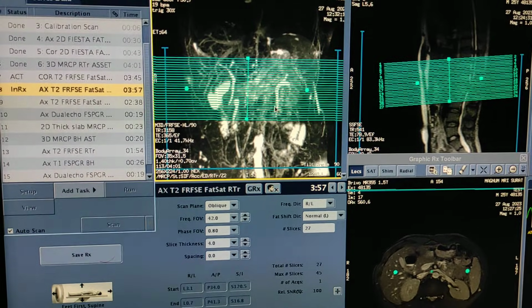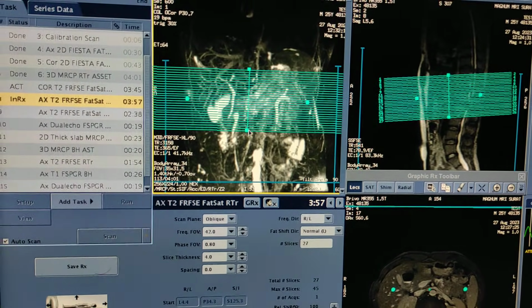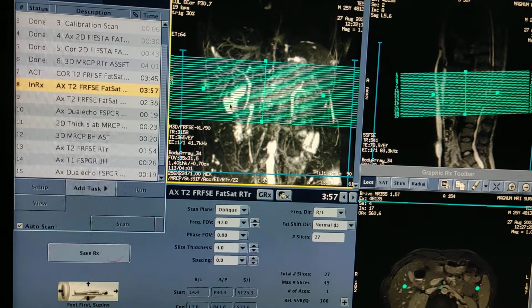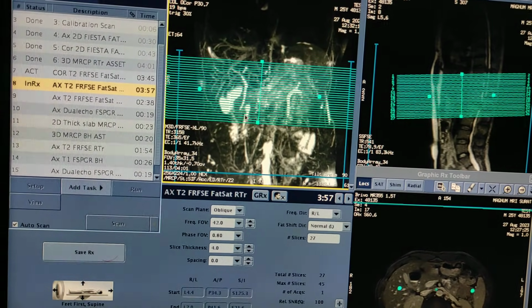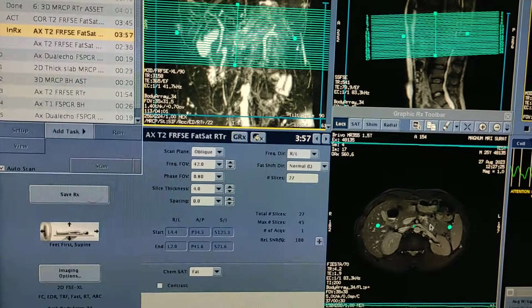So here is the planning. You have to take 3-4 slices extra. Simply you have to cover CBD, gallbladder, pancreatic duct, and the lower end of CBD is very much important. Sometimes there is a tiny stone in the lower end of CBD.